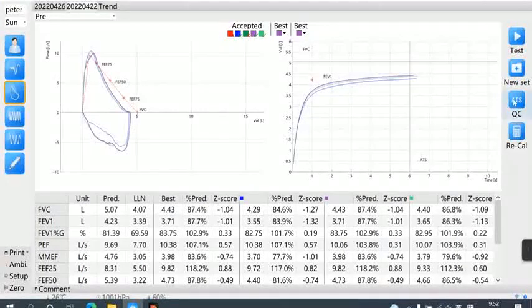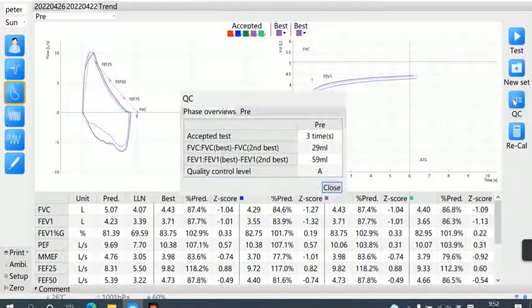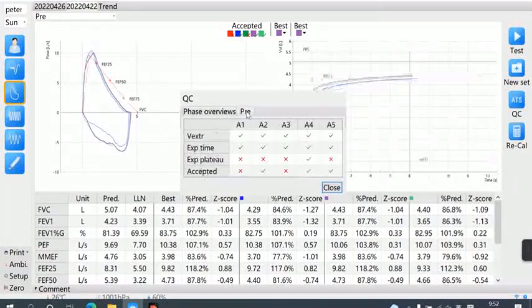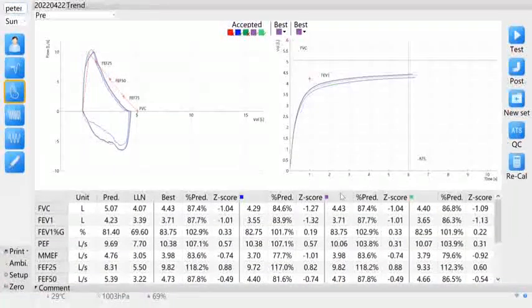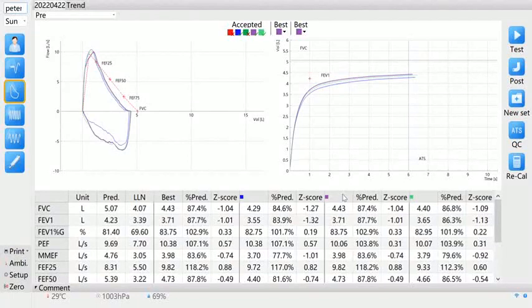Click Quality Control on the right to view the current quality level. If the grade is above grade C, it is acceptable. If the grade is D and below, or the grade needs to reach grade A, it needs to be tested again. Click the upper right corner to start the measurement, then click the upper test, and conduct the third blowing according to the first blowing process.